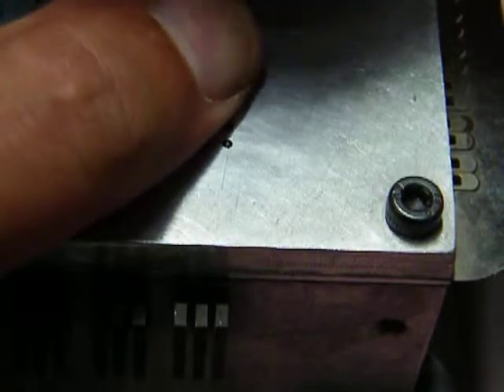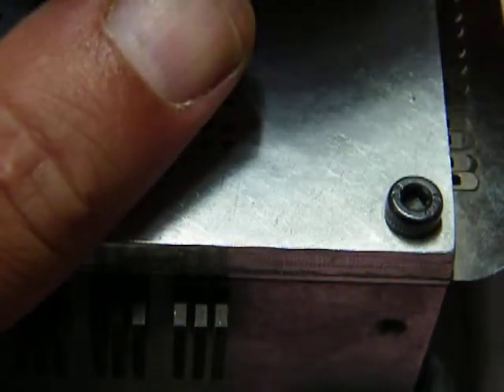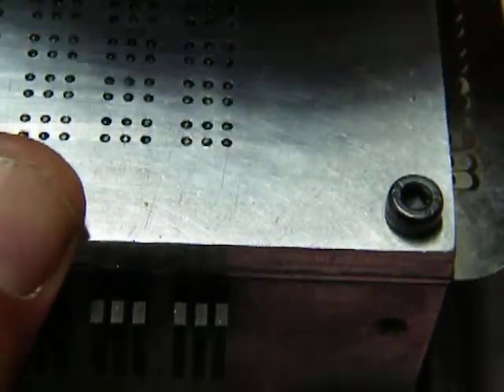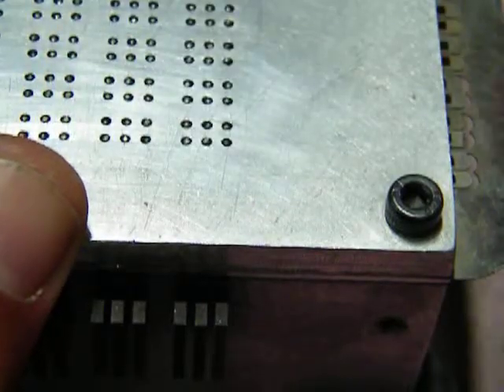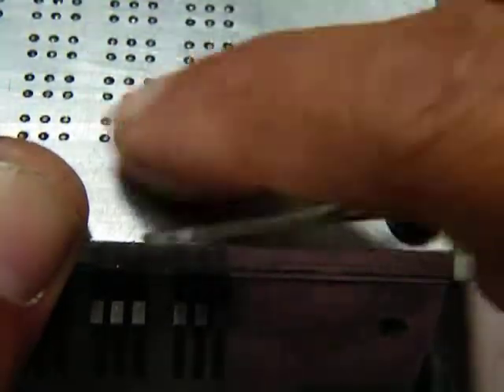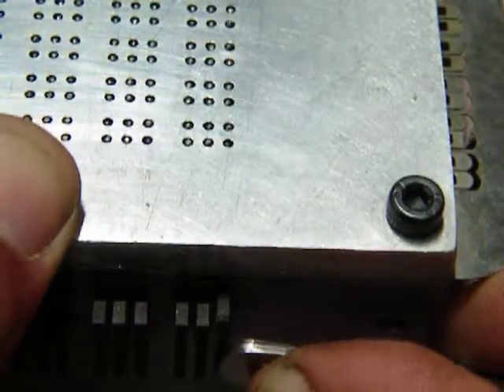But now when they're latched, it's different. So what happens is when they're latched, I'm just setting them a minute. Latch shut, all are latched shut now. I'm talking about only the first three cells that you can see. So when they latch shut, even when you trigger the row actuator, nothing happens.